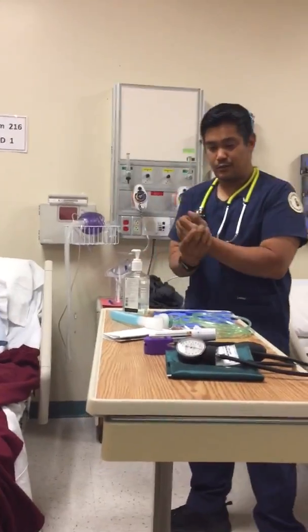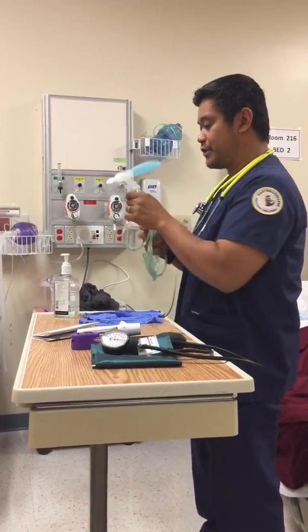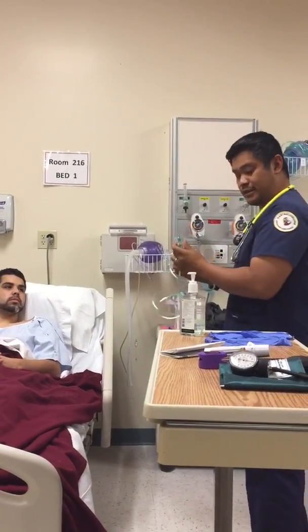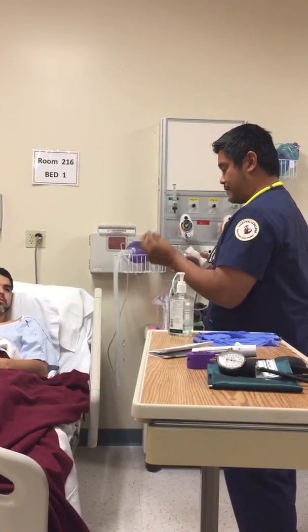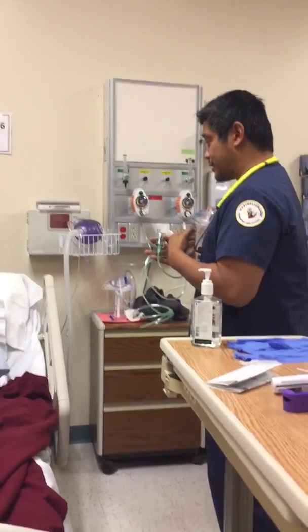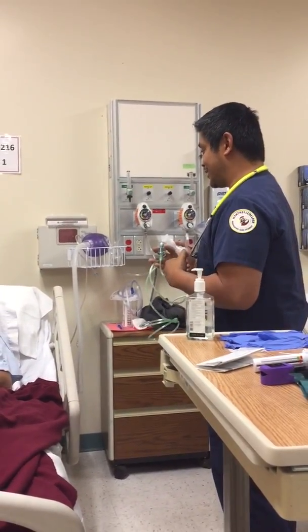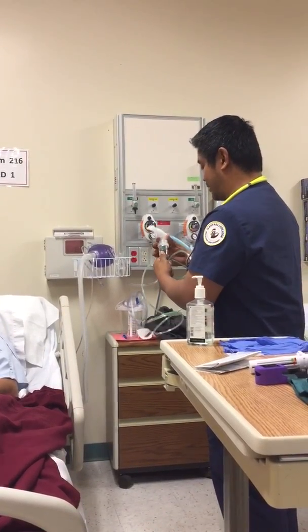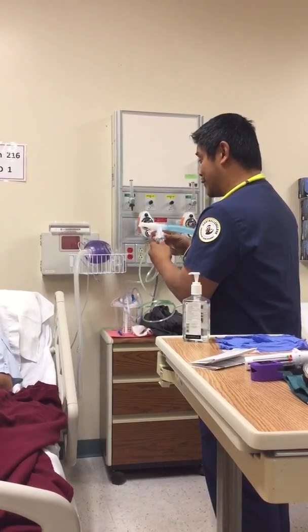All right, Christian. So we're going to be doing what we call an SVN treatment. This is a small volume nebulizer. The medication is actually going to go into this little cup here, and the medication is albuterol, and it's going to help with some tightness in your chest, and our chart is showing that you have a bit of difficulty breathing right now. This will definitely help with that. This is attached to a gas source, which is right behind over there, and it'll basically aerosolize the medication and allow you to breathe with it.